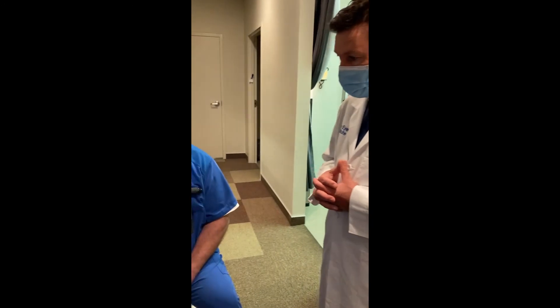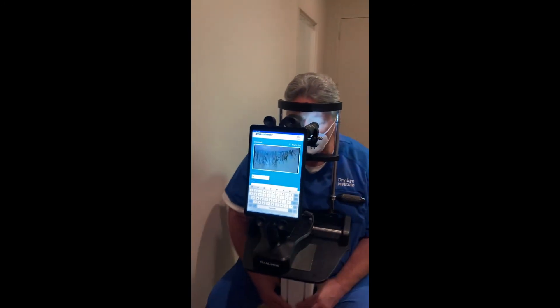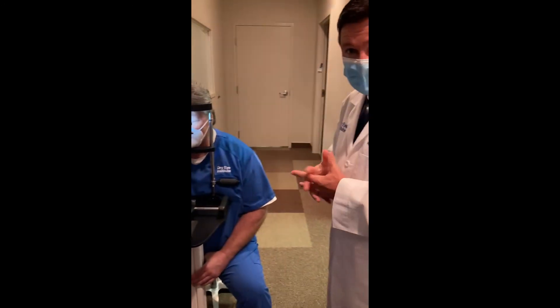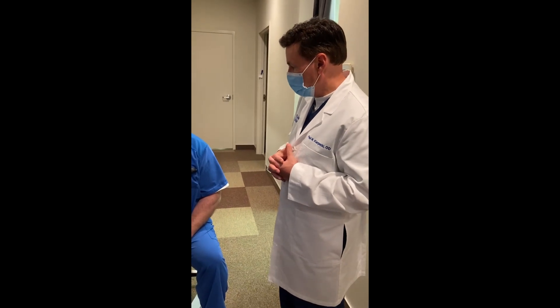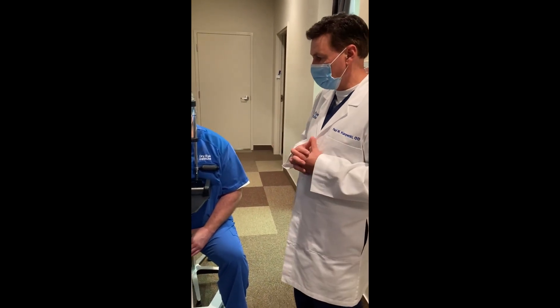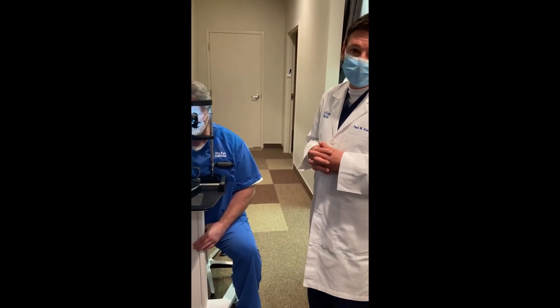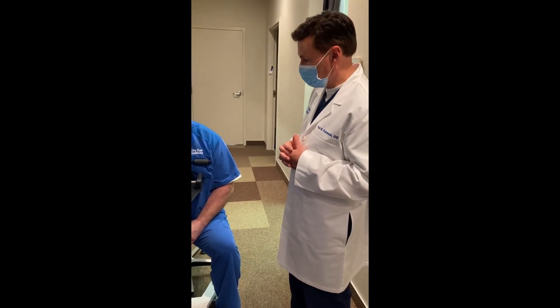Excellent technology, both for meibography as well as for external eyelid imaging. You're able to completely capture blepharitis, whether it's MGD or external eyelash blepharitis.